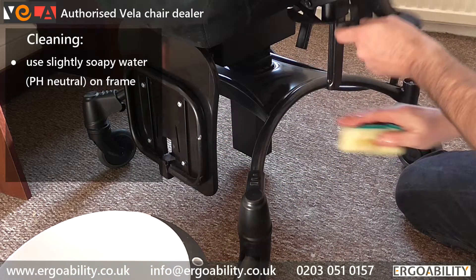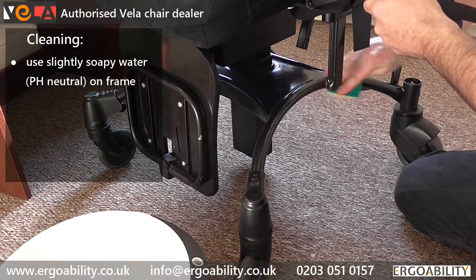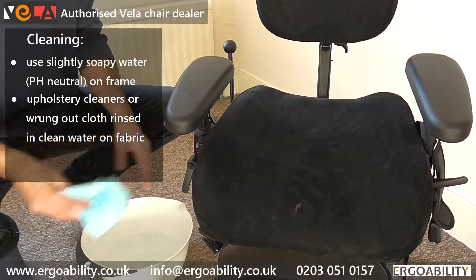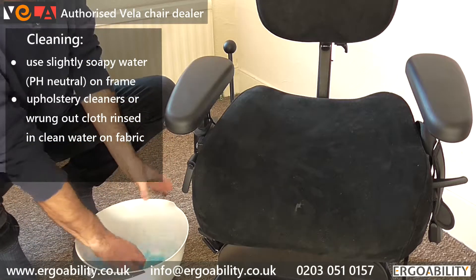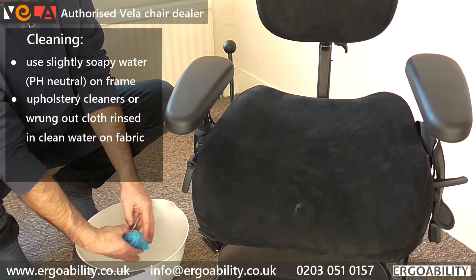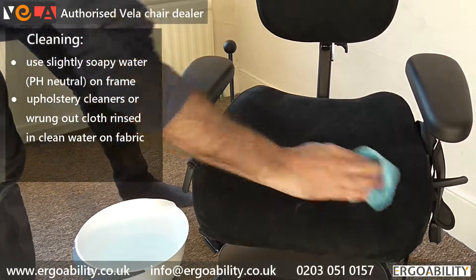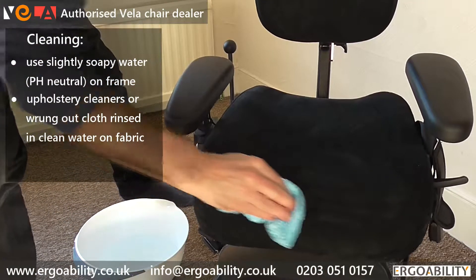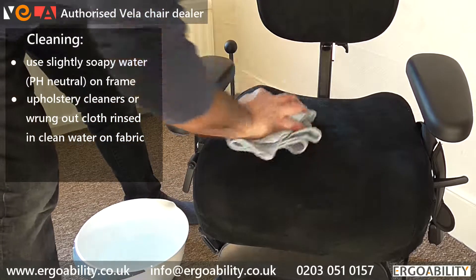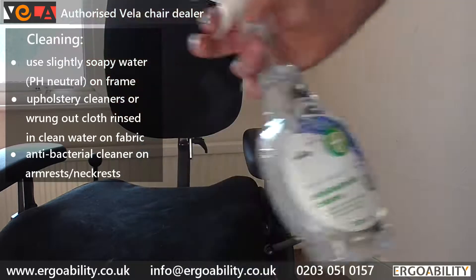The frame can be cleaned with slightly soapy water, preferably using a pH neutral soap. The upholstery may be cleaned with upholstery cleaners or wiped with a tightly wrung cloth rinsed in clean water. You can use anti-bacterial cleaner on the armrests and neckrests.